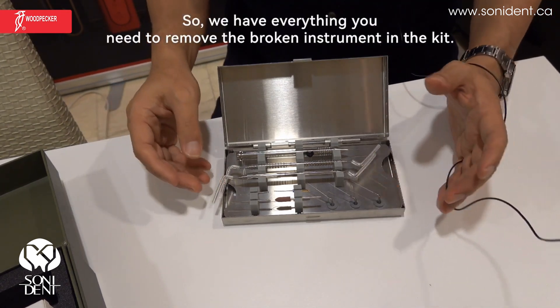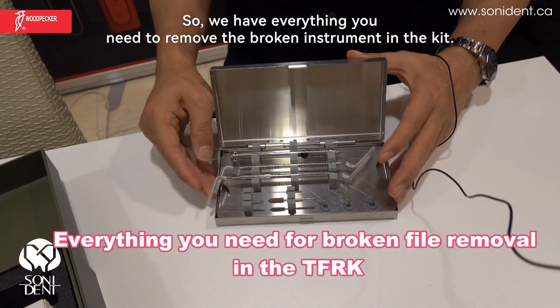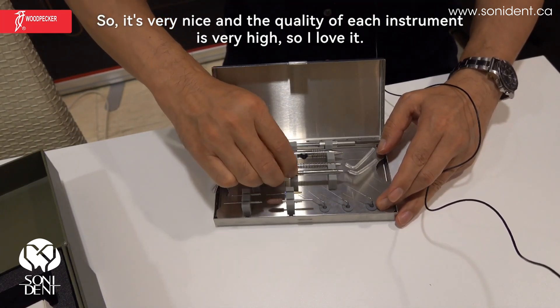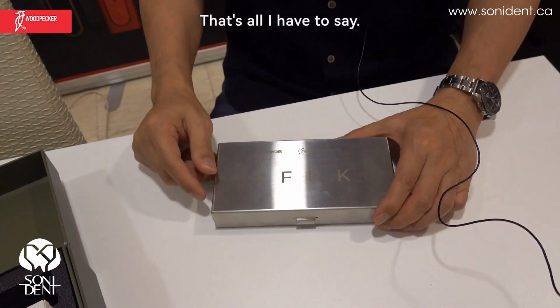So we have everything you need to remove the broken instrument in the kit. It's very nice, and the quality of each instrument is very high. Thank you, that's all I have to say.